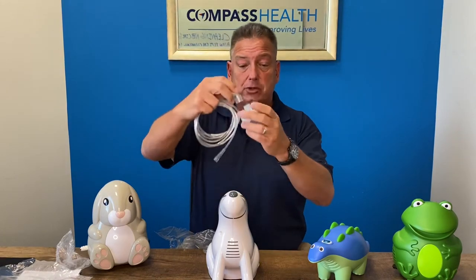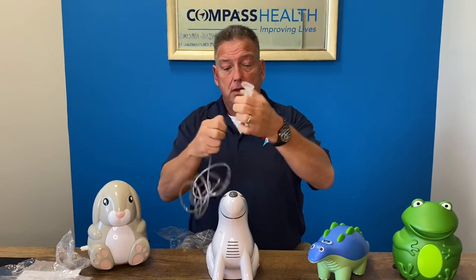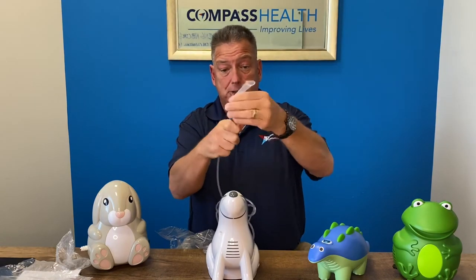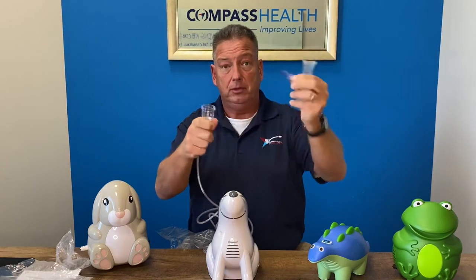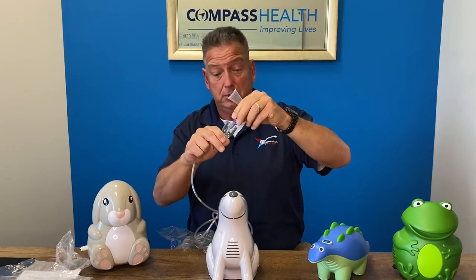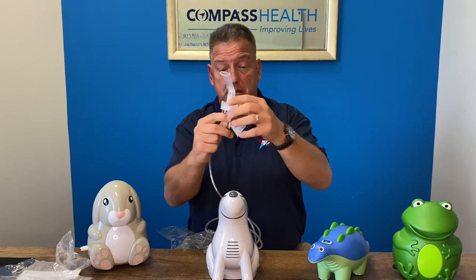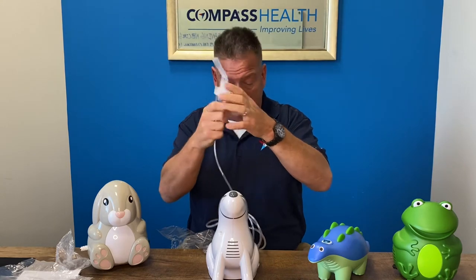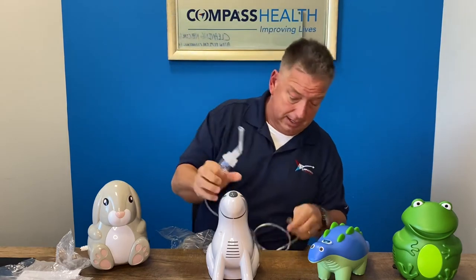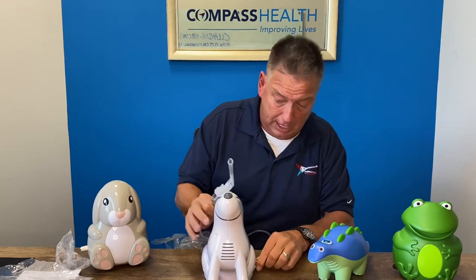You have your top load piece here with your mouthpiece. Your medicine cup opens as the traditional ones do. You do have your removable piece in the middle that needs to be removed for cleaning. So you put the medication in there, tighten it up, slide your tubing on the bottom, and then the other end of the tubing will go on the recessed output port.